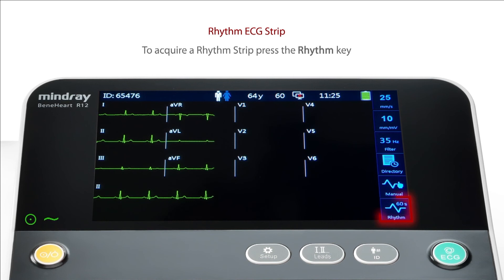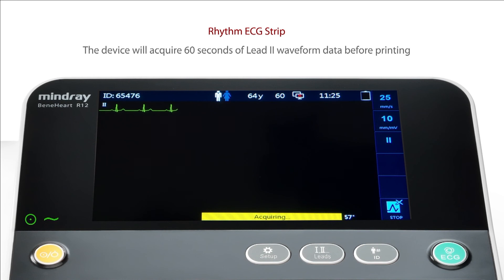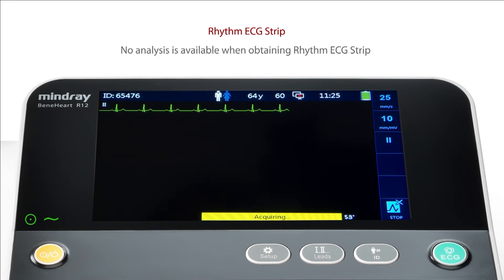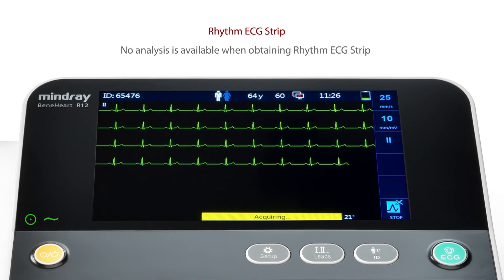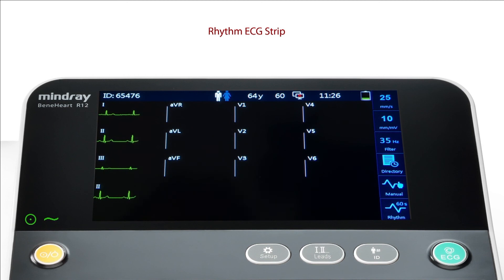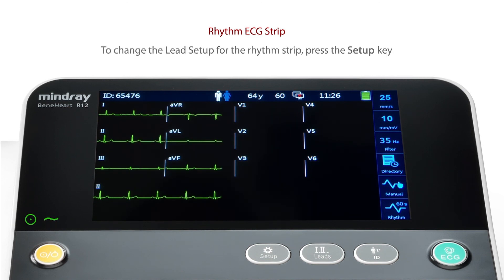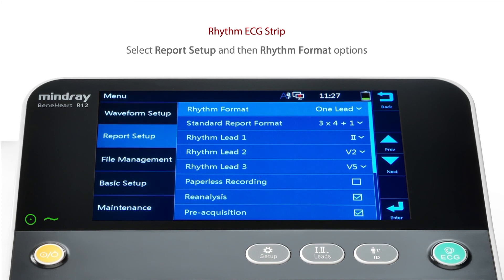To acquire a rhythm strip, press the rhythm key. The device will acquire 60 seconds of lead waveform data before printing. To change the lead setup for the rhythm strip, press the SETUP key. Select Report Setup and then Rhythm Format Options.